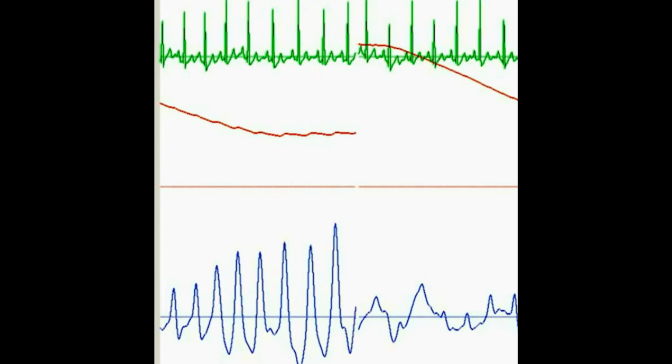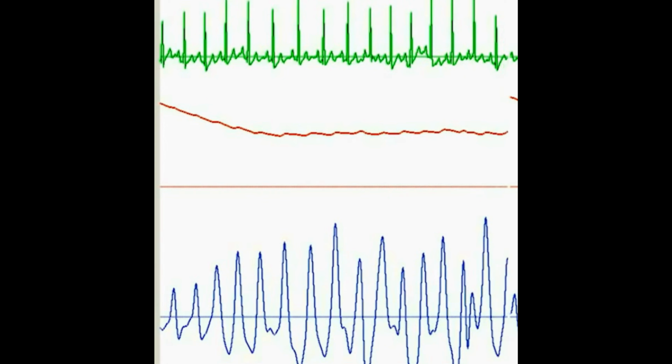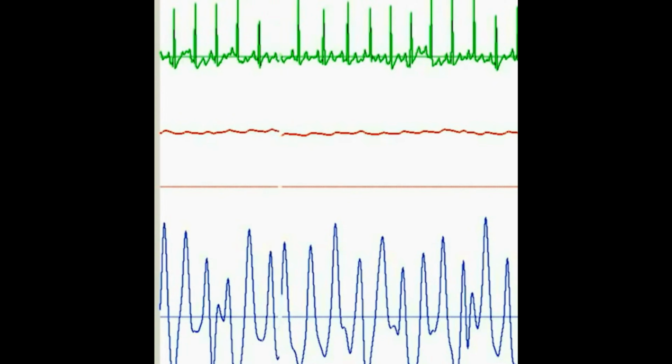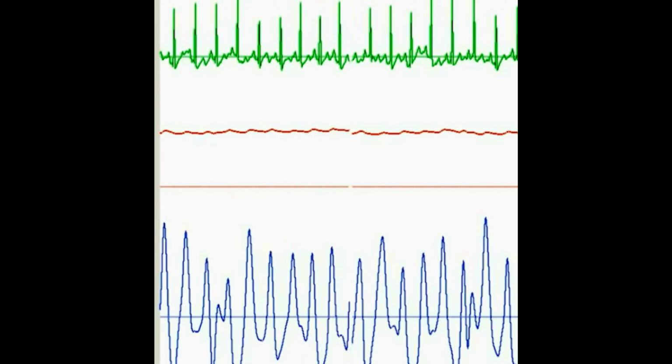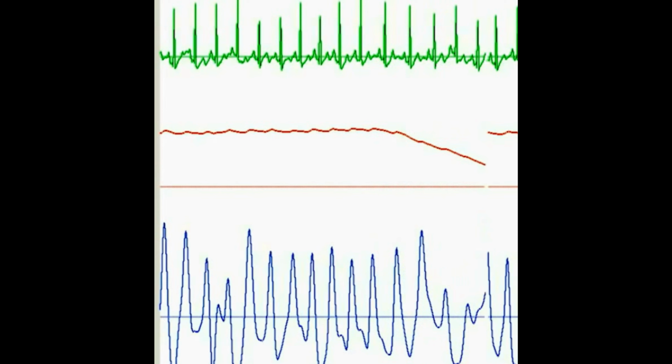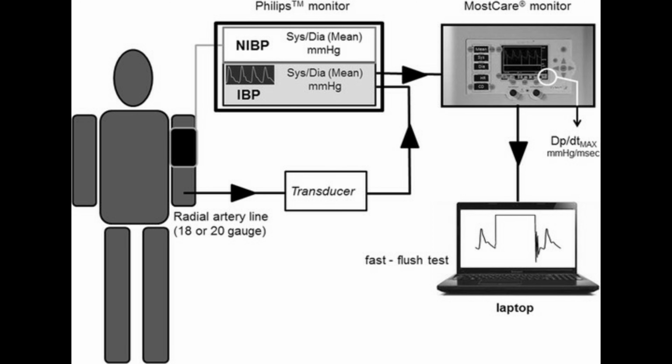Then we release the pressure and you can see the red graph dropping down and again coming to a baseline where the vascular unloading is happening. The blood is allowed to flow freely and the pulse is stopping. So that is the diastolic. This is how the monitor is reading the NIBP. Manufacturers of NIBP monitors use the oscillometric technique.